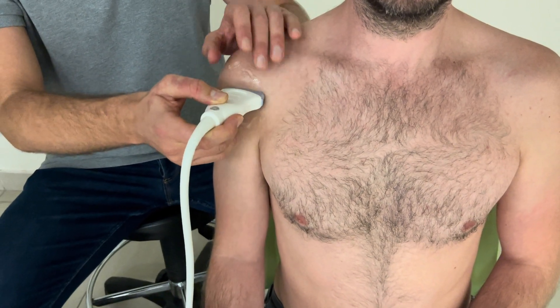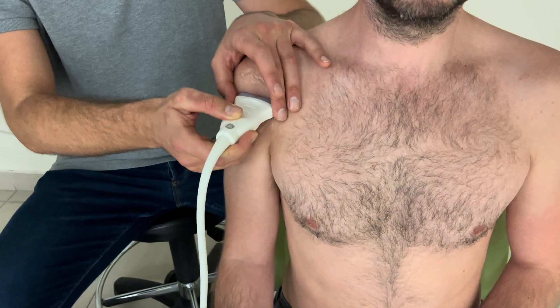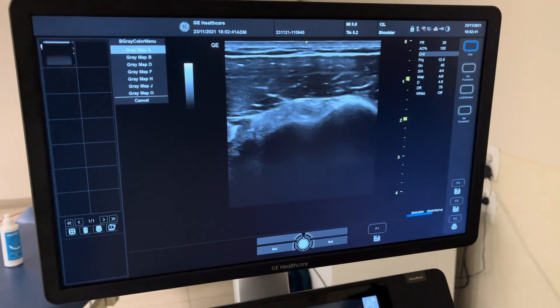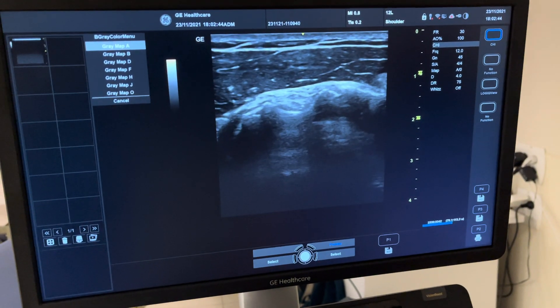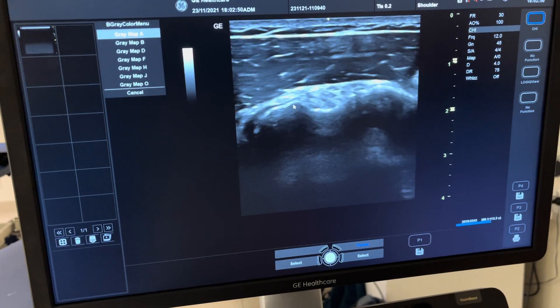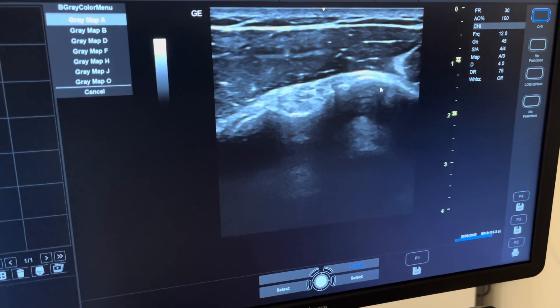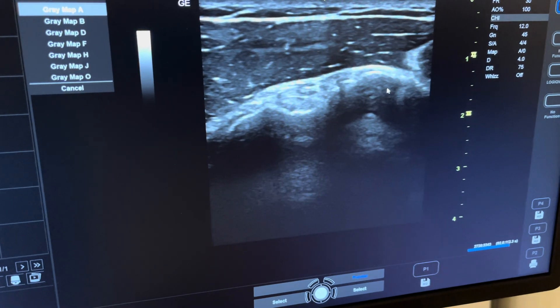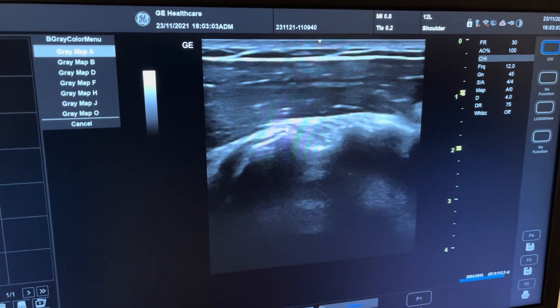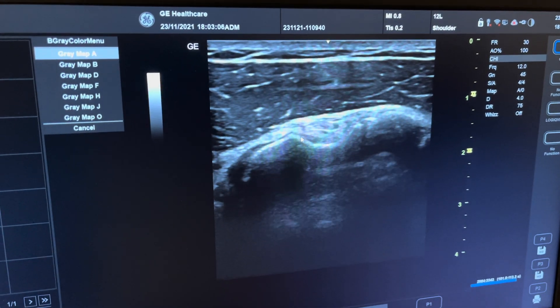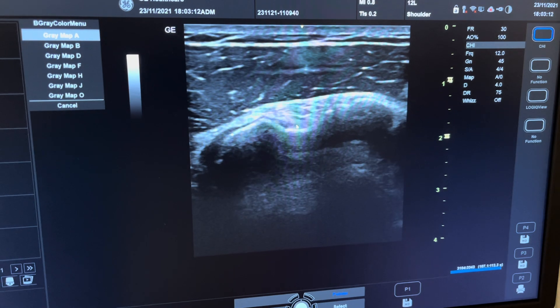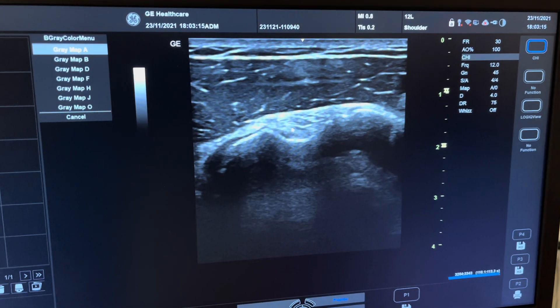Scanning angled upward is a common mistake. Place the probe here, then we look at the image and find the two important landmarks for this scan: on the left, the lesser tuberosity, and the greater tuberosity. The bone line in between is the intertubercular groove, and we have the tendon lying above it — this is the biceps tendon.